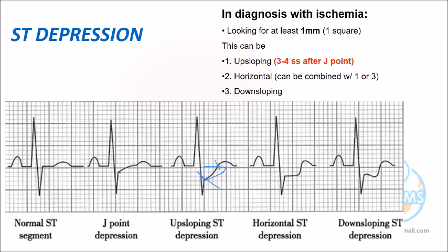But if it is 3 or 4, some authors say it is 4, from the J point. So in the ECG shown here, is it normal or abnormal? Normal. This is the difference. This is an exceptional message for you, regarding ST segment depression.